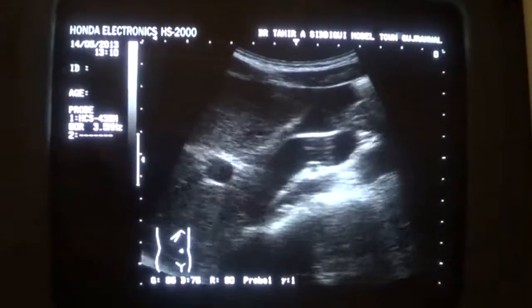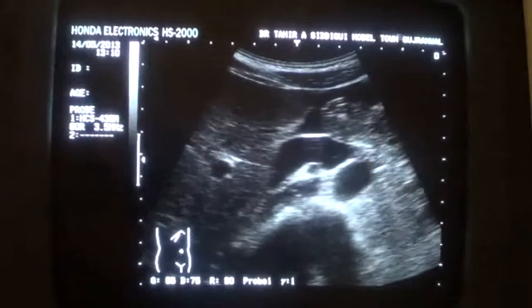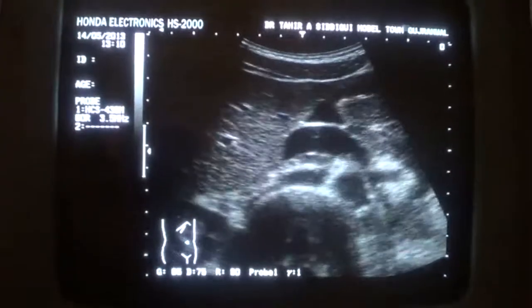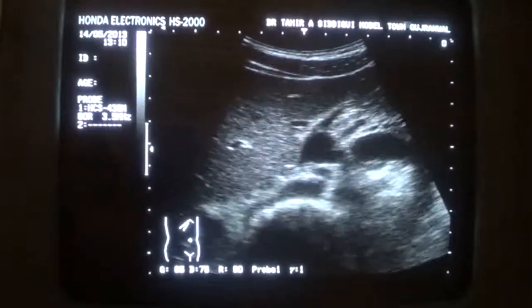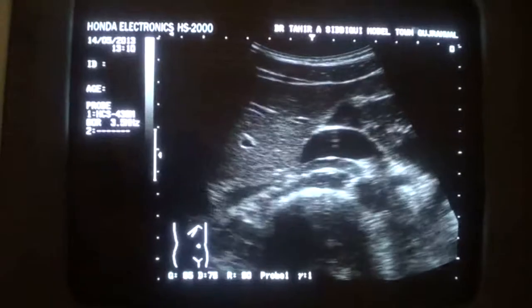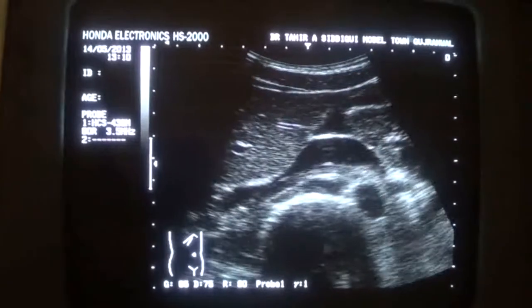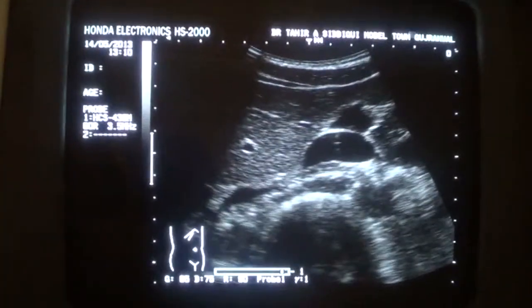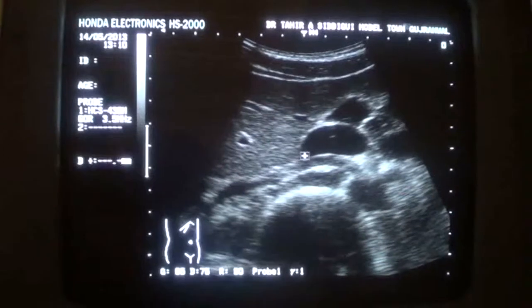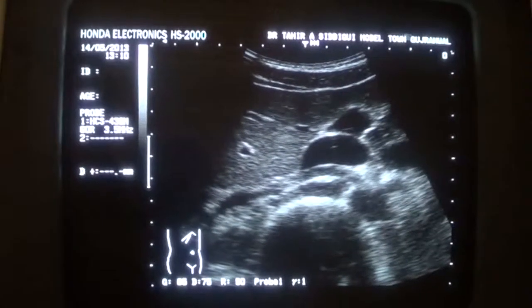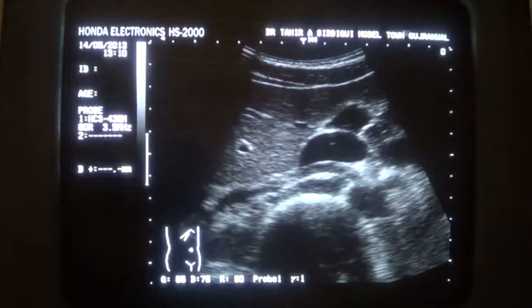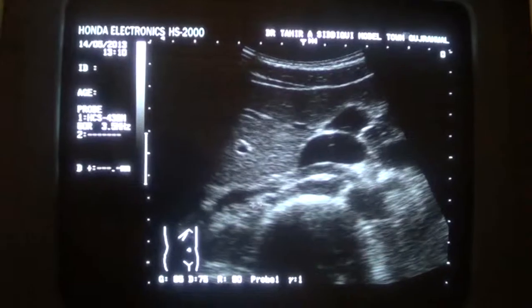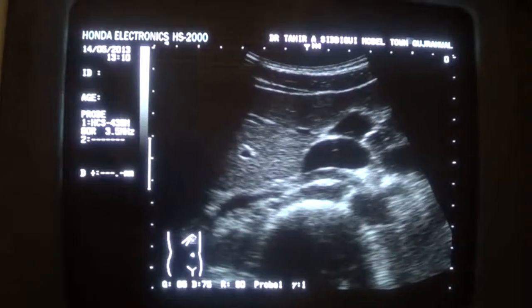I am going to give a 90-degree sweep to the probe to see if this vessel enters — you can see that this vessel emanates from the hilum of the right kidney.